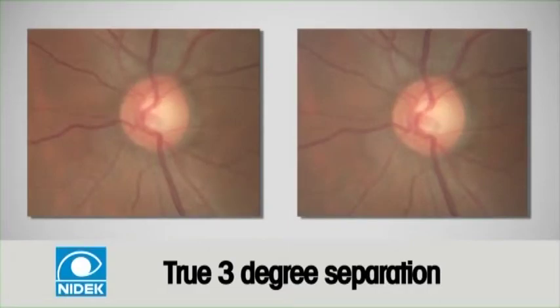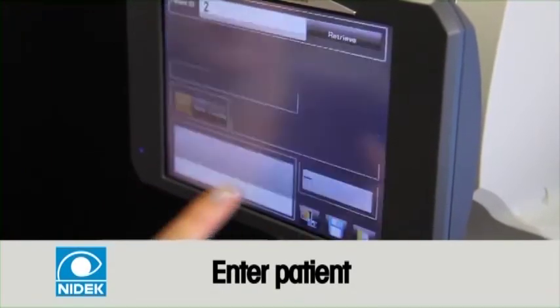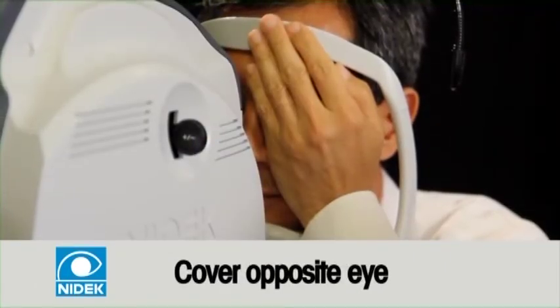Stereo images are two separate images captured at a true 3-degree angle. First, enter in the patient's demographics. Second, select the stereo icon. Align patient and have them cover their opposite eye to better see the green fixation.